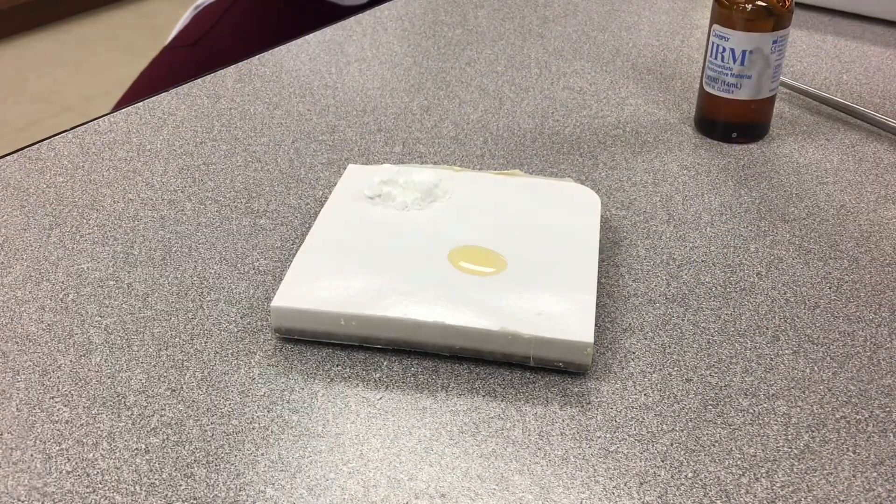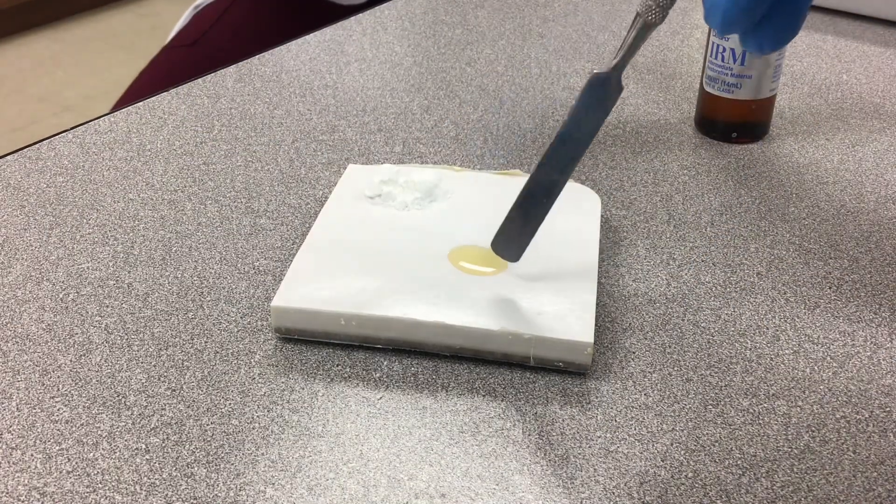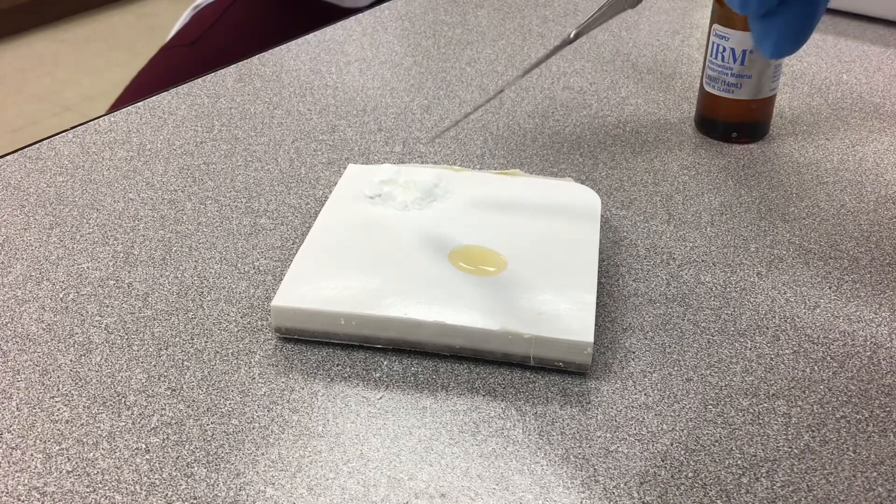Now, if you notice, I put my powder away from my liquid. You don't put the liquid on top of the powder.